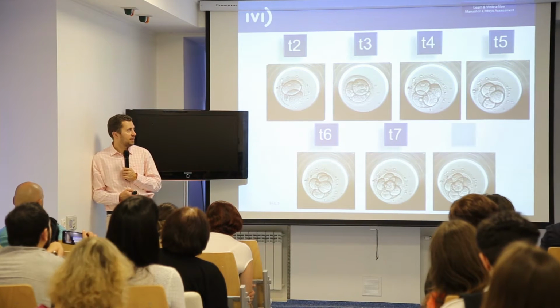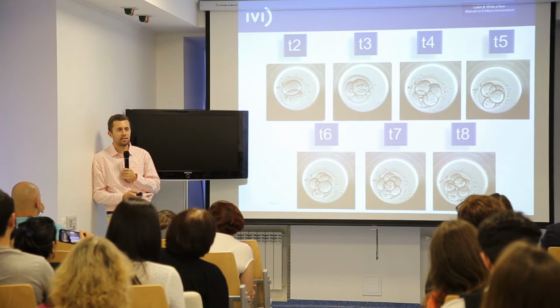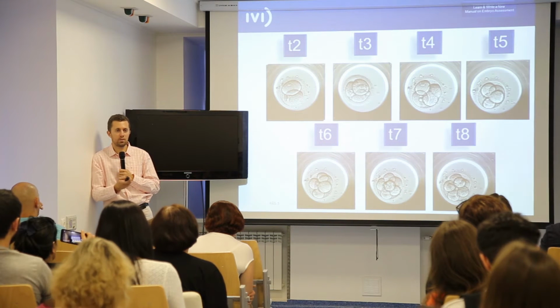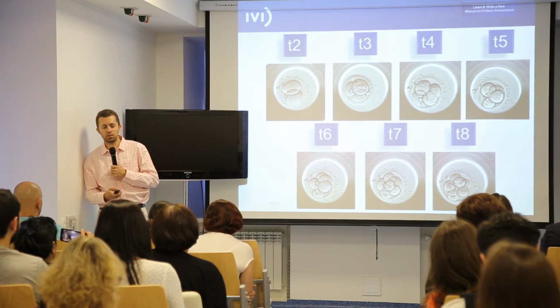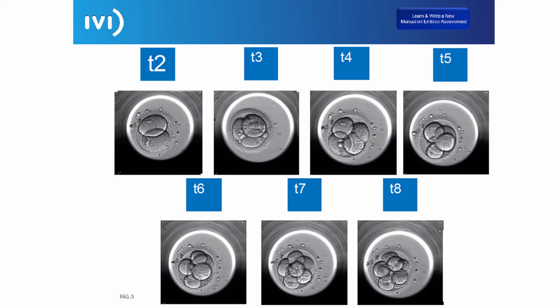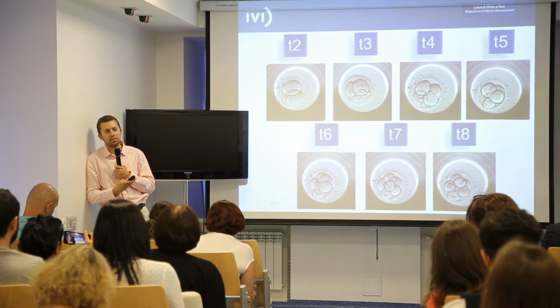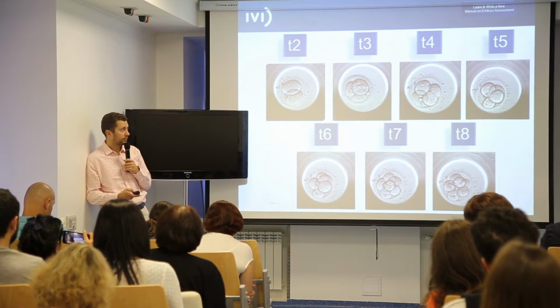One of the things that is important with these parameters is that they are so easy and so objective to measure. It's difficult that between me and some of you, we would make any mistake in annotating the time of the cleavage of the embryo to 2 cells, 3 cells, or 4 cells. For sure we are going to share the same value. It's obviously very objective, because there will be no difference between us in annotating that kind of thing, and it's already published, in fact.